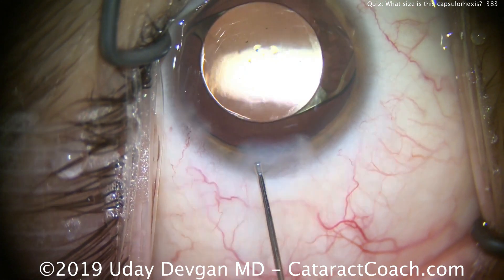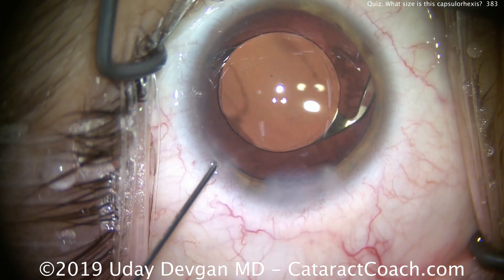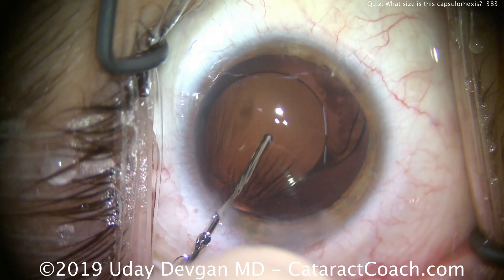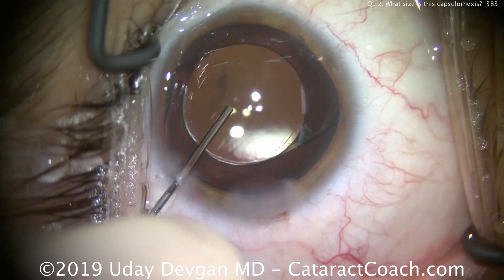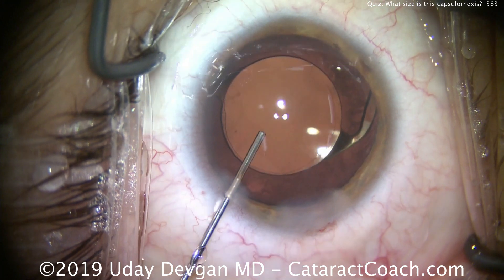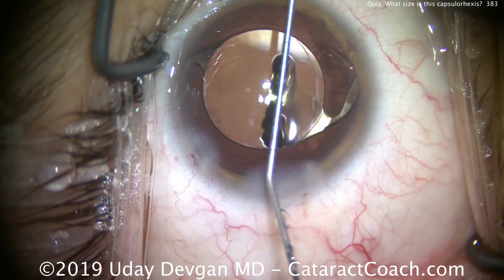In this case, due to the patient's pupil size — even in dark conditions it didn't exceed 6 millimeters — this lens is a great choice. There it is: the optic overlap by the capsular rhexis looks perfect. The answer to the quiz is: this capsular rhexis is just right.